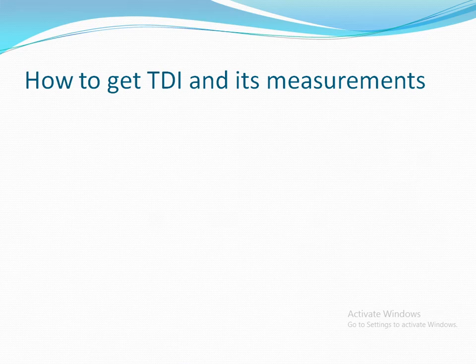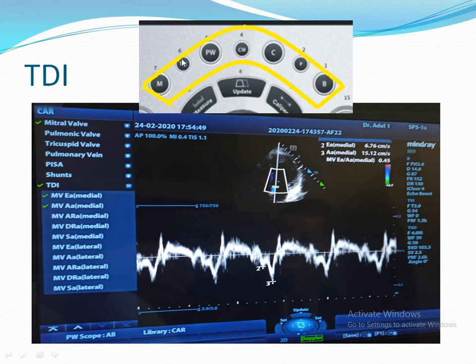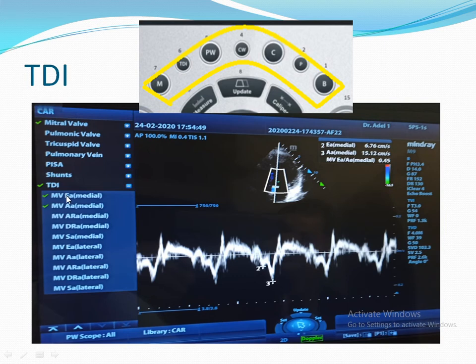How to get Tissue Doppler and its measurements: choose the Tissue Doppler button, then select pulsed wave. You can place the sample volume medially or laterally — here we put it medially. Go to the waveform, press Measure, select the Tissue Doppler image, and you will have Mitral Valve E and E' medially. If you place it laterally, measure from that position to get Mitral Valve E and E' laterally.